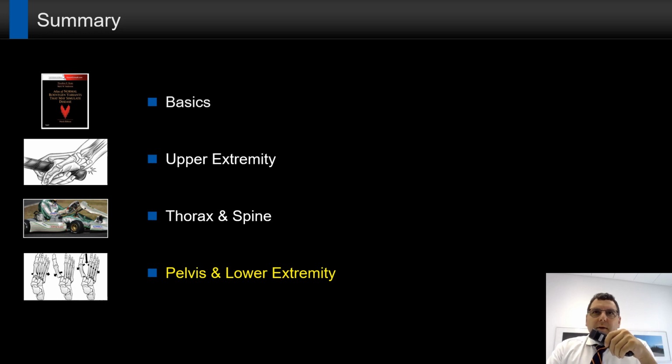So in the past minutes we have talked about some basics, the upper extremity fractures, the thorax and spine, and my case of the race driver, and then about the pelvis and lower extremity fractures.